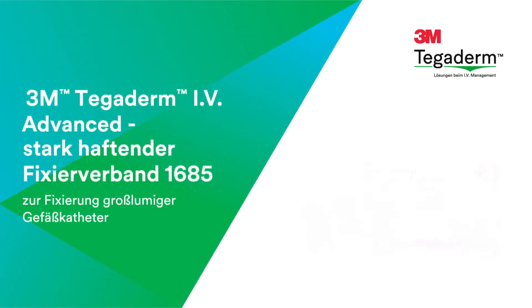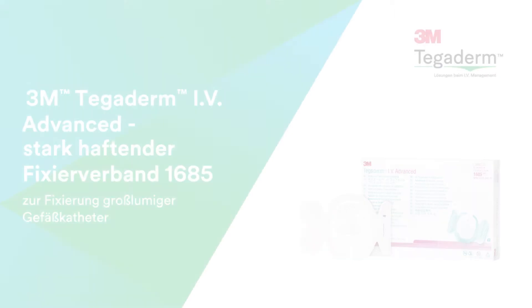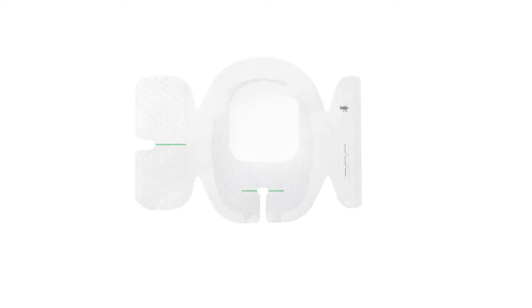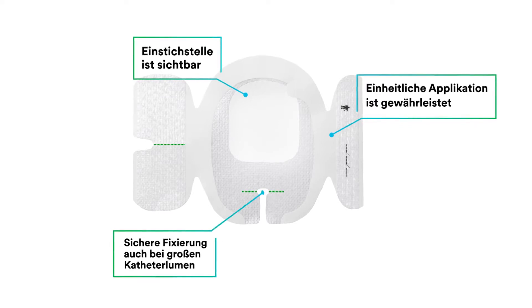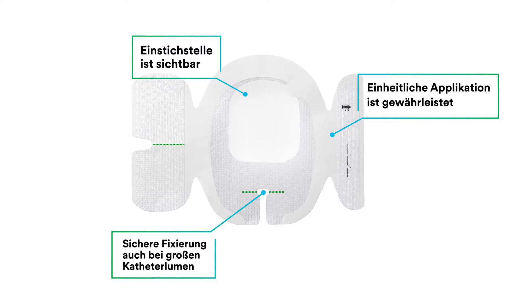In this video, you'll learn how to apply and remove 3M Tegaderm IV Advanced Securement Dressing 1685 on a multi-lumen introducer inserted in the internal jugular. Tegaderm IV Advanced Securement Dressing offers site visibility, consistent application, and advanced catheter securement with perforations that allow it to fit securely around large catheters or devices.